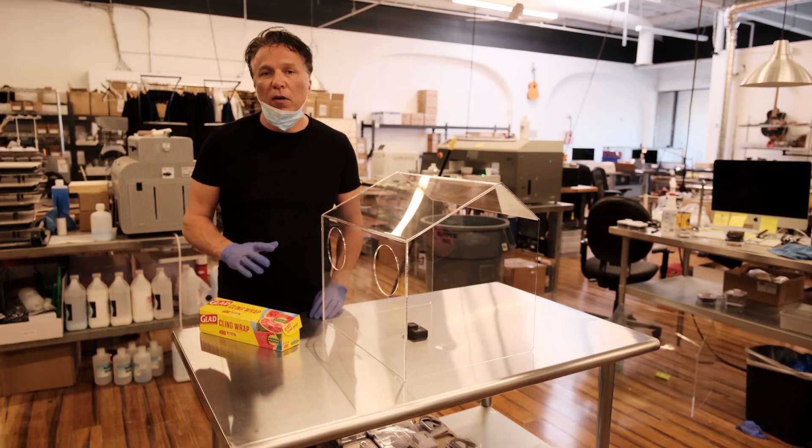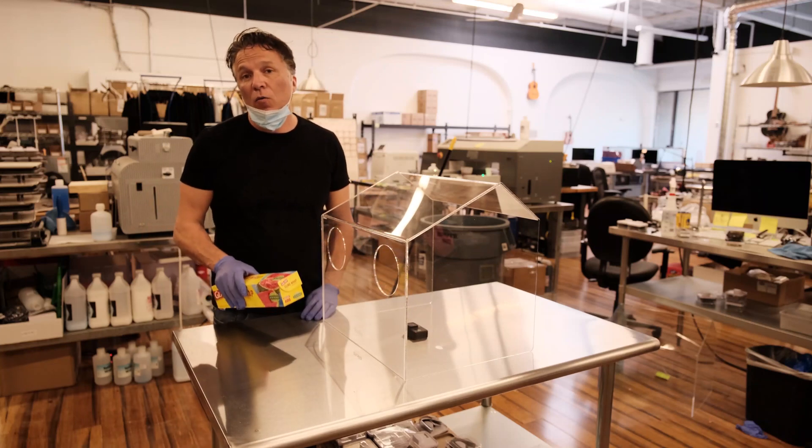I'm going to show you how to prep the Thalia box so that it's ready to go when you need to intubate somebody.